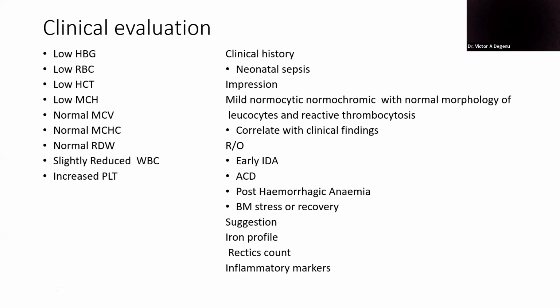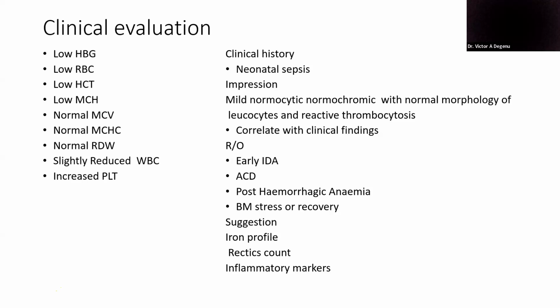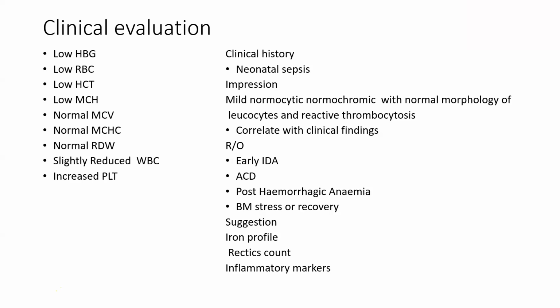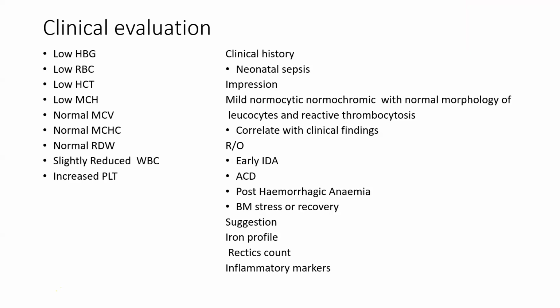Okay. Are you trying to tell us that based on the output of the machine, we should get a fair idea of what the blood film is going to look like? Yes. What we will be expecting in the film that we are going to prepare. So it will give you a clear indication on what you will be expecting. And if you are not expecting those things, then you go back again and redo your full blood count to get your suspicion and your query on what you are looking for. Exactly.